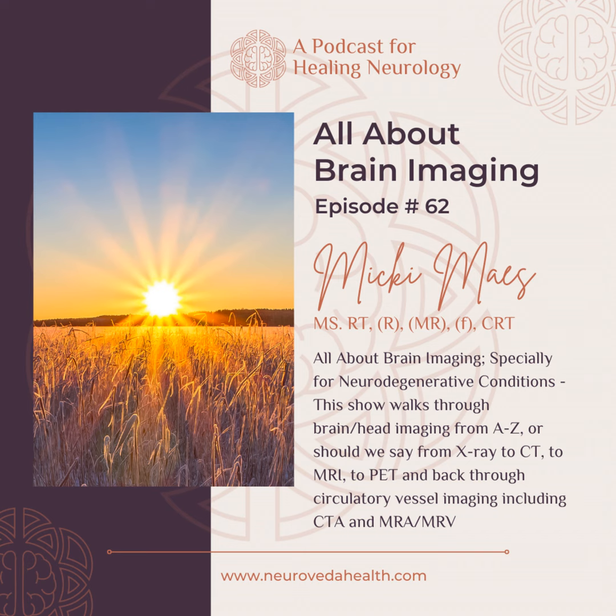That's great. And that analogy of the loaf of bread is fantastic, because you can imagine that your loaf of bread can be oriented ear to ear, from top to bottom of your head, from eyes to the back of your head. The different protocols and the different slices, you can reconstruct them, but you still need to be targeting what you suspect is there. You need to have a sense of what you're looking for in order to pick how to look for it.